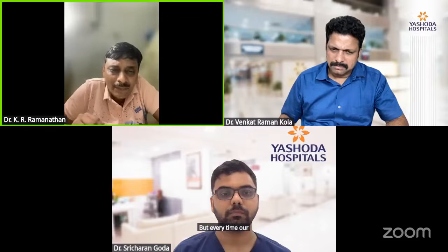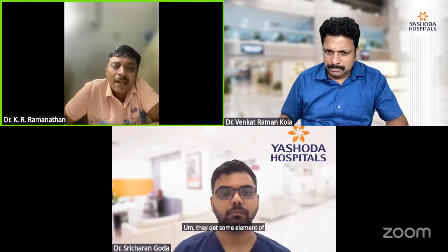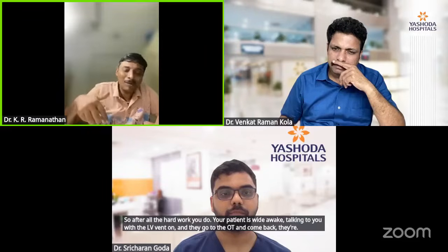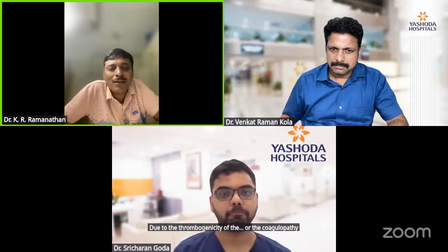But every time our patient's LV recovered, we realized that when the LV vent comes out, they get some element of stroke, because of the thrombus or clot sitting there. After all the hard work you do, your patient is wide awake talking to you with the LV vent on, and they go to the OT and come back, they're hemiplegic or hemiparetic, which we thought was either related to the cannula or due to the thrombogenicity or the coagulopathy associated with all this.